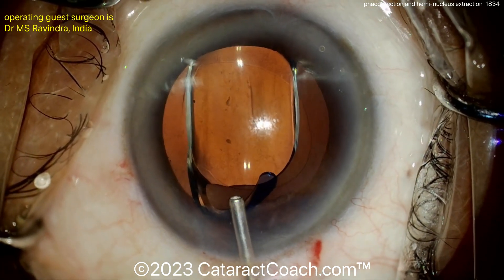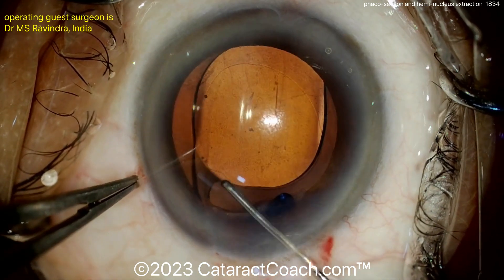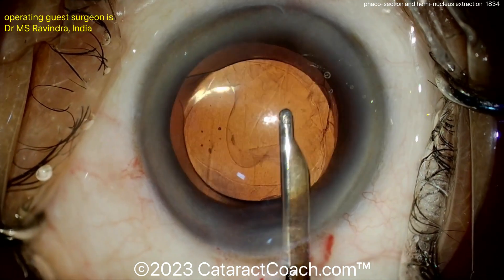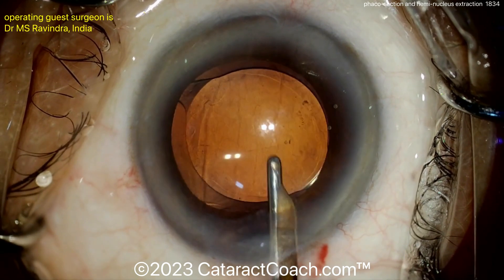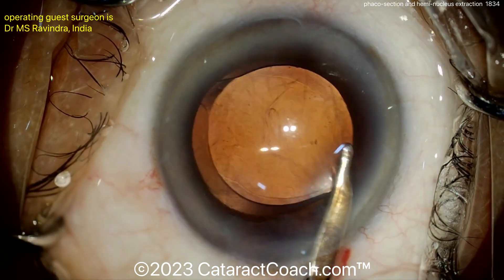Even then, the surgeon is going to be able to use just hydration to seal the corneal incision. Again, there will be some astigmatic flattening of this meridian, but it looks like the surgeon is operating at the 180-degree meridian — so against the rule. Typically these elderly cataract patients tend to have astigmatism against the rule, so perhaps this incision could even be helpful for those patients.